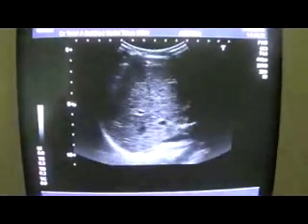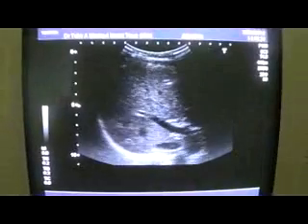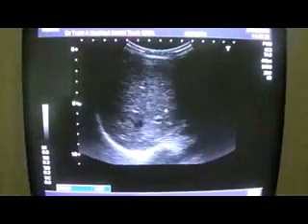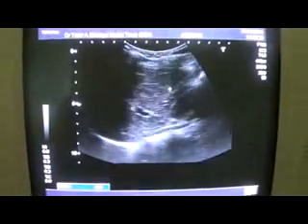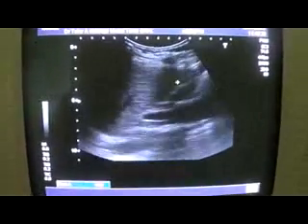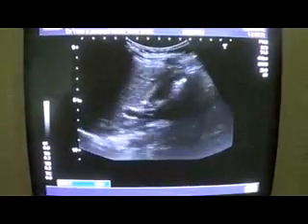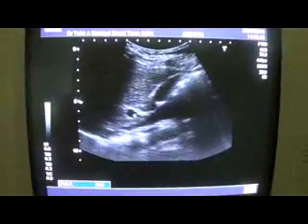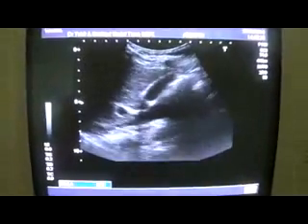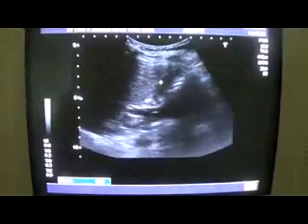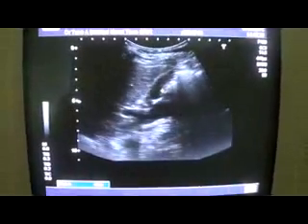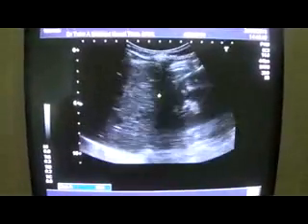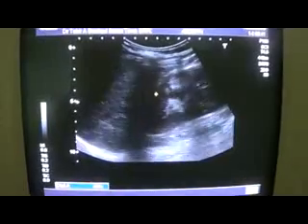This is the liver, this is the portal vein, and this is the gallbladder — you can see the portal vein at the neck of the gallbladder. When I focus on the kidney, however, I find significant findings.